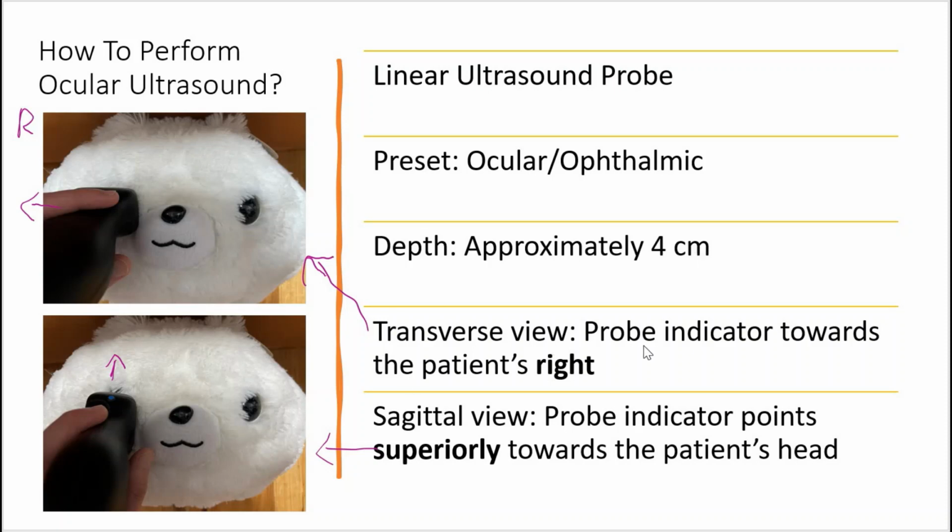First, I start in the transverse view, where the probe indicator points towards the patient's right, as shown in this image here. And then the sagittal view, where the probe indicator points superiorly towards the patient's head, as shown in this image here.